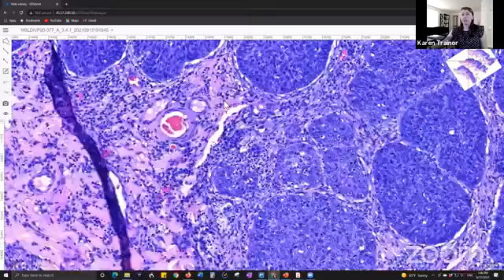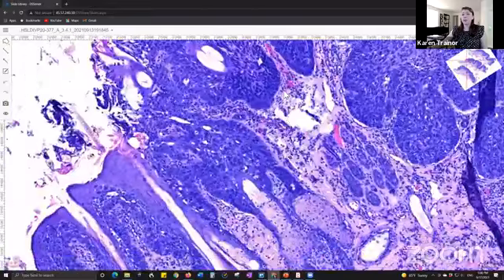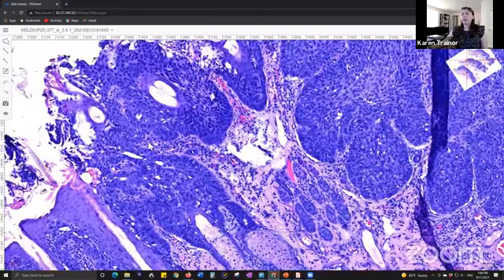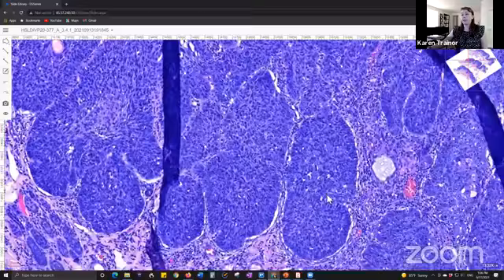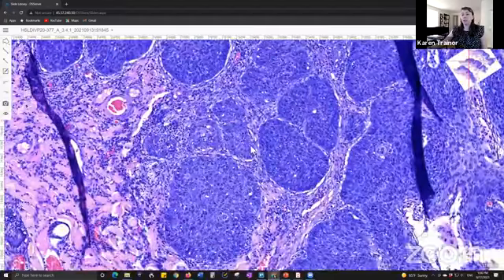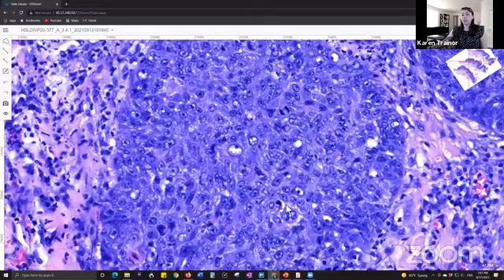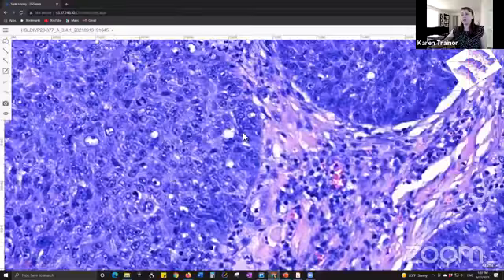So this lesion is called Bowenoid squamous cell carcinoma, and when it respects the basement membrane, it's called Bowenoid squamous cell carcinoma in situ or carcinoma in situ. There's a lot of different variations, permutations of the name. It can progress, certainly, in more advanced lesions to become invasive squamous cell carcinoma, and that's what's happened with this particular lesion. We can see all of the mitotic figures. There's one here, here. You can see the cells are jumbled and getting very disorganized.